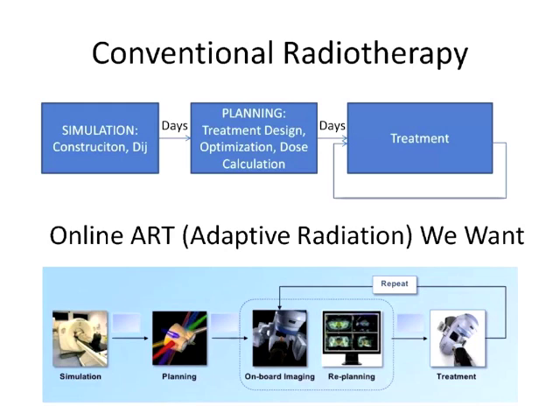After that, the tools are so slow that you cannot do it in real time in 1 day. So a few days later, the simulation output is handed to the oncologist doctor, and the doctor plans where to shoot the radiation to reduce the tumors.